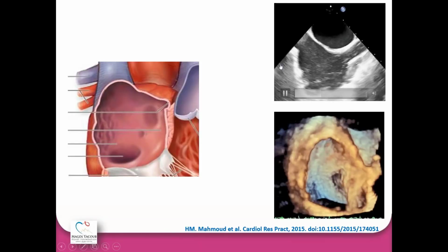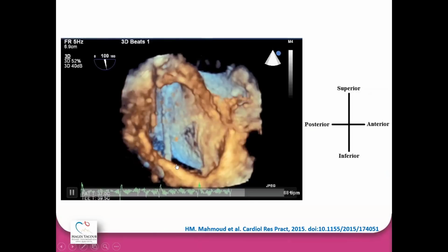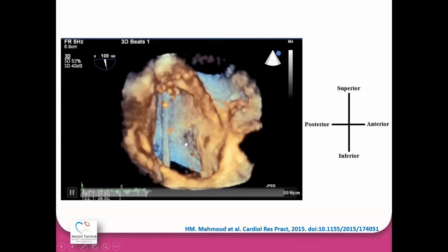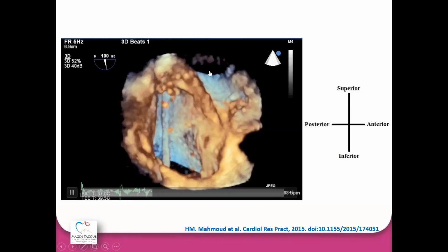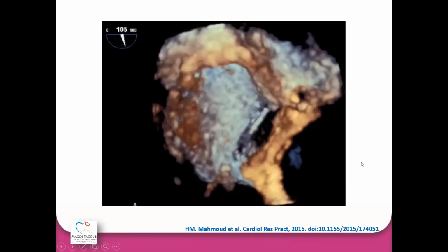This is an unfair comparison between 2D and 3D-TEE. During septal puncture, here is the catheter introduced from the IVC towards the SVC. So the interventionist can see the catheter, and can see the fossa, which is the faint part of the septum. The aortic valve is here, the aortic root is here. So you can see everything in one view without even looking at the fluoroscopy.